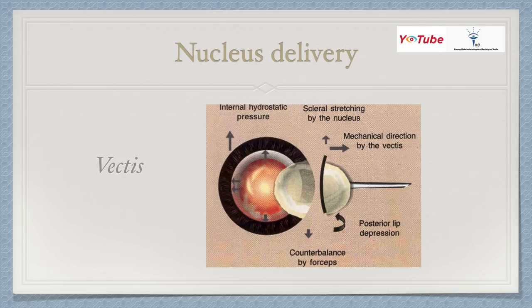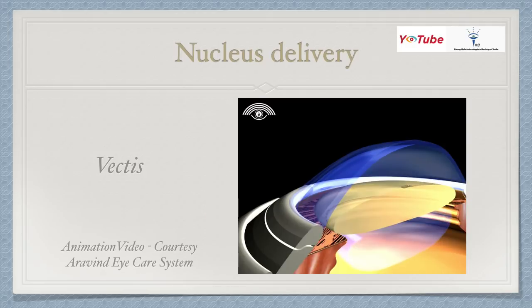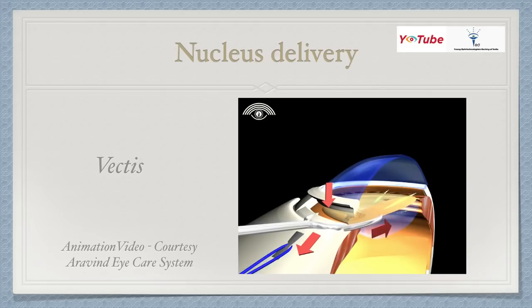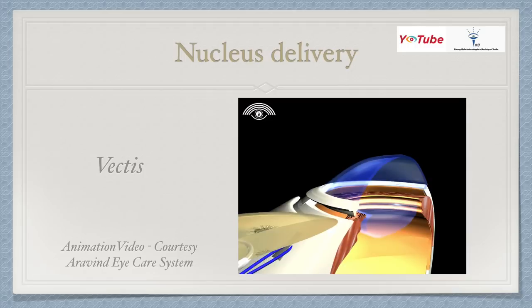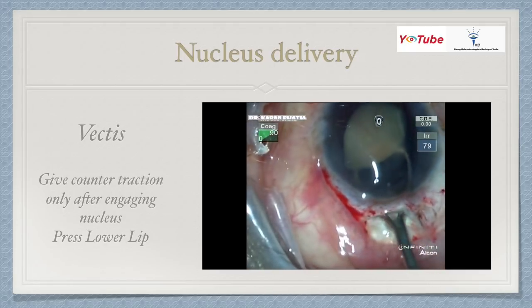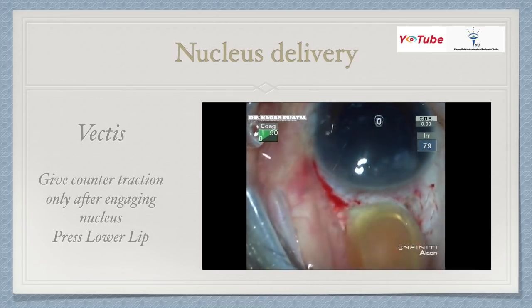Another method is vectis delivery. With the vectis, you hold the lens; it causes scleral stretching by the nucleus. By depressing the posterior lip and giving counter-traction with the superior rectus bridle suture or forceps, the nucleus is delivered. With an irrigating wire vectis, internal hydrostatic pressure is produced when BSS is injected, helping to extract the lens. In the video, you can see the nucleus being engaged with the vectis, the lower lip of the tunnel is depressed, and the lens is taken out. If the lens is small and not coming out, hold it with the vectis, give counter-traction, and bring it out through the tunnel.